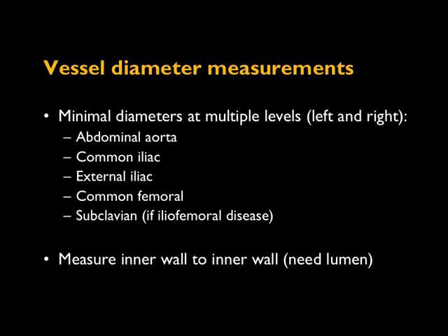Measurements are obtained at multiple vessel levels: the minimum diameter at the abdominal aortic level, the iliac artery level (both common and external), and the femoral artery level. If the vessel is too small, the device won't be placed there due to the risk of vessel rupture.